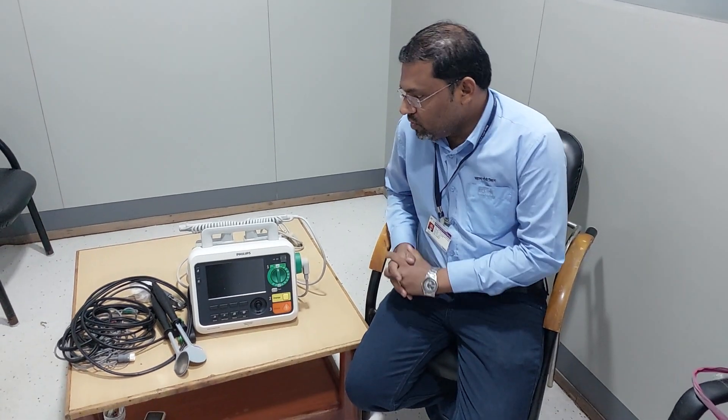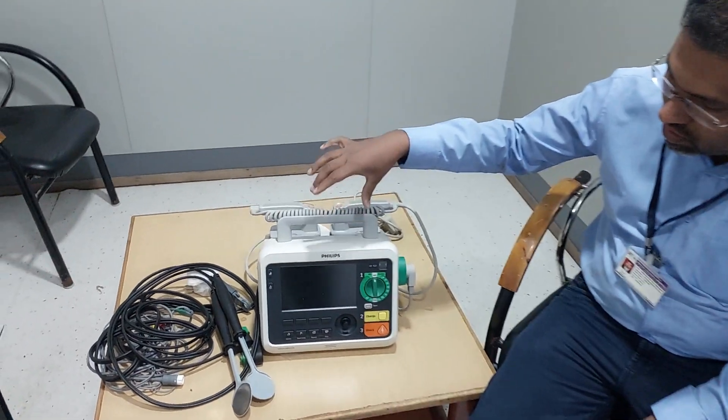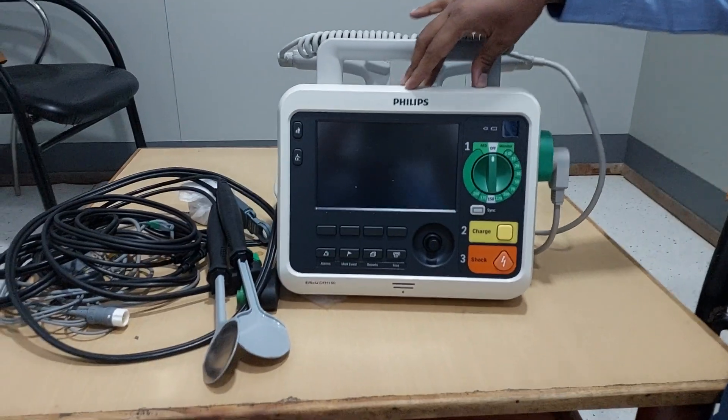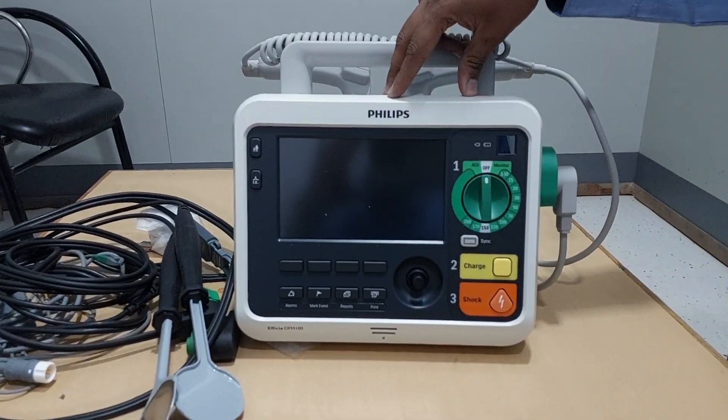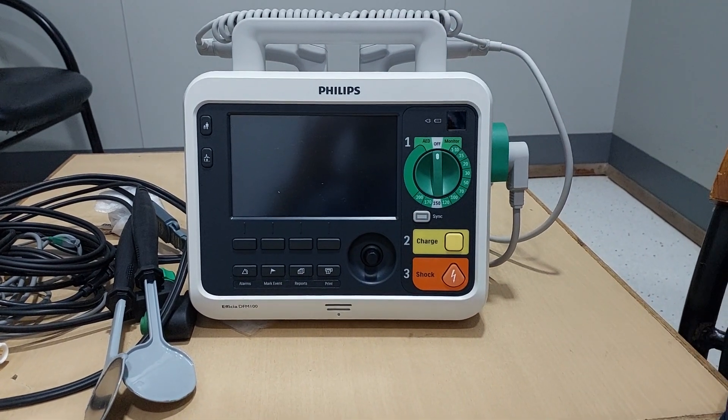Hello guys. Today I am going to give you basic application training regarding the defibrillator which is made by Philips — this is the Efficia DFM100 model. Now, how to operate this machine basically.